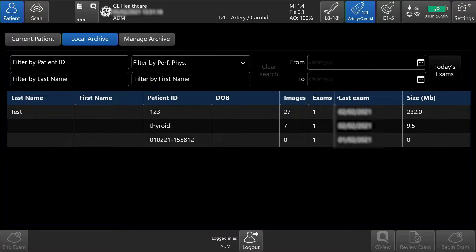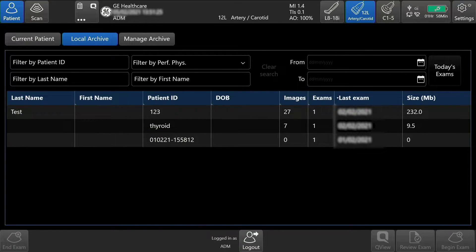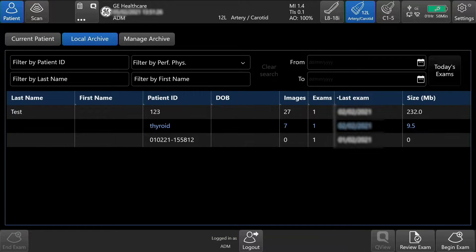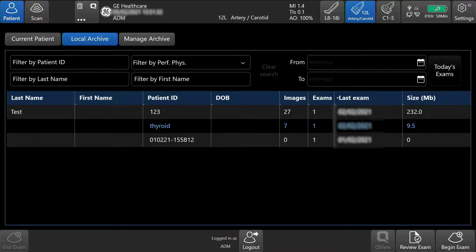To review an exam, tap the patient's exam. In this case, I will tap Thyroid. Then tap Review Exam on the bottom right-hand side of the touch screen.